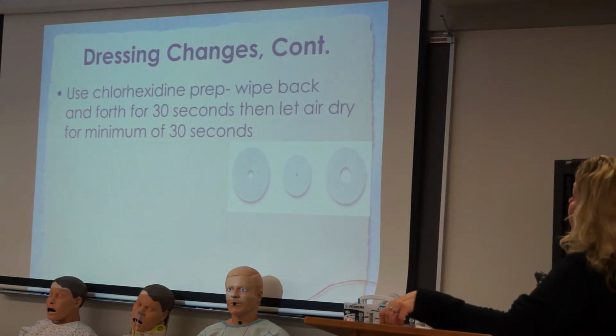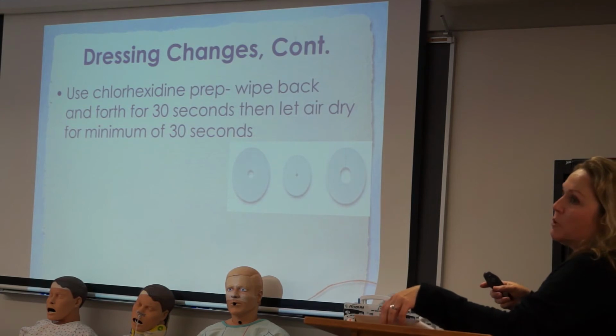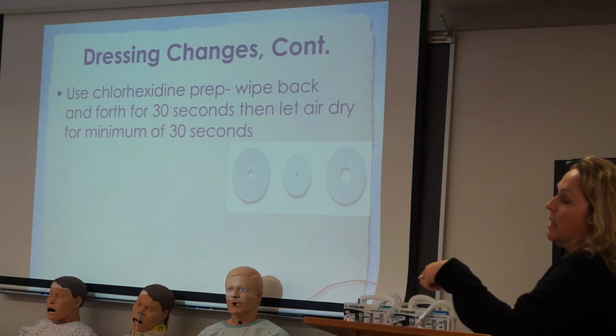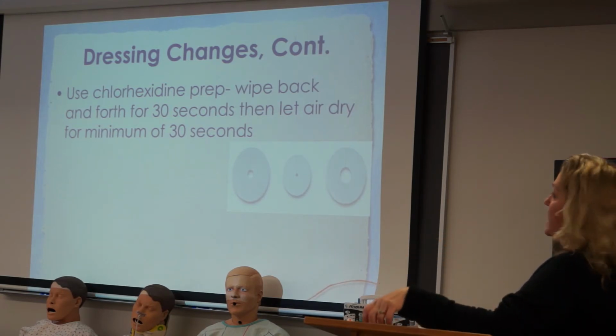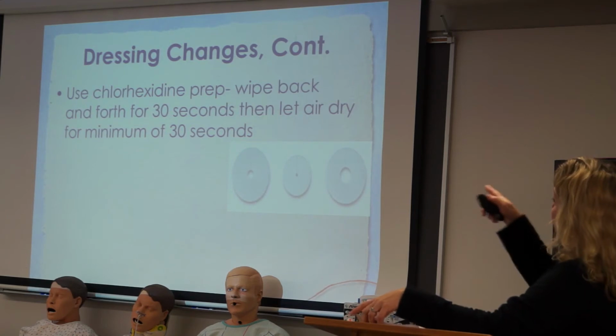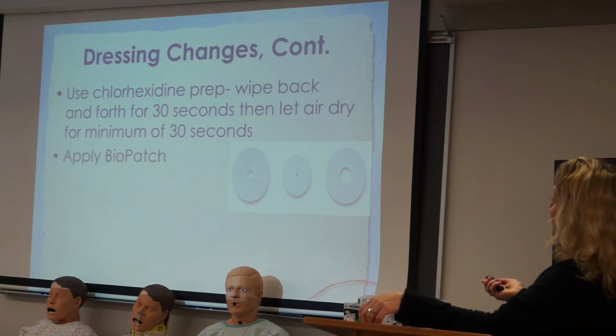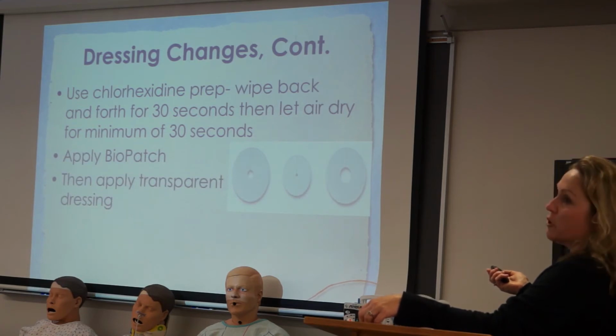BioPatch, yeah. So biopatches have been demonstrated to really help reduce infection risks. So when you're changing your dressings, the first thing you do after you've cleaned the site is put a biopatch around the insertion site. And you wipe back and forth, like we talked about, for 30 seconds and let it air dry. Apply your biopatch, then apply your transparent dressing.